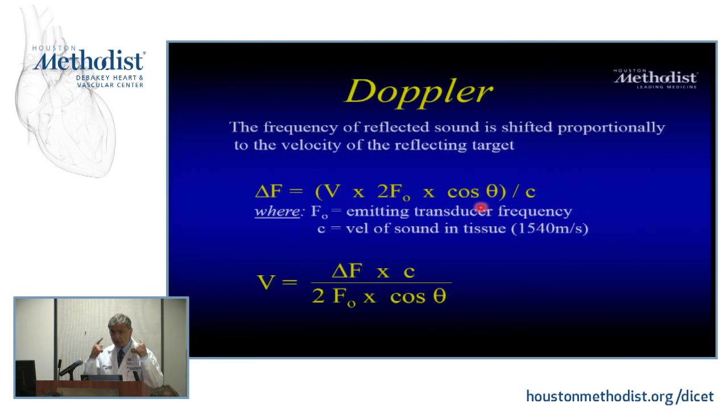You get your best change in frequency if you're actually on that line. If I'm sitting here and I'm far away from this line that it's traveling on, I won't hear its frequency shift. I'll hear the same frequency, nothing changing. Why? Because I'm perpendicular to the trajectory and it's too far. Same thing's going to happen here.